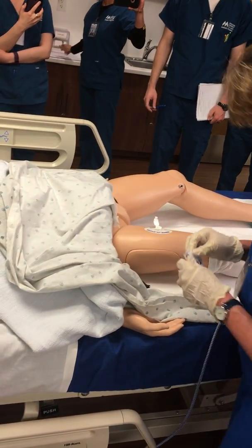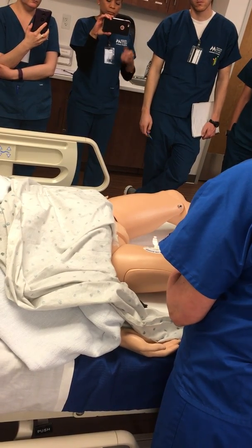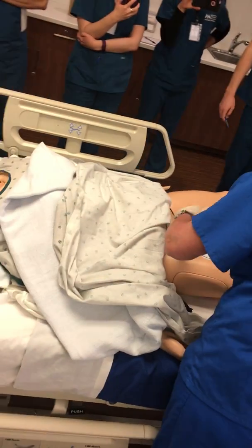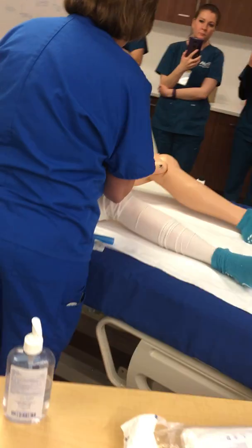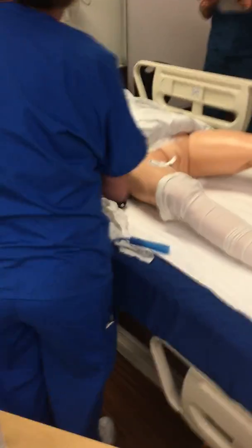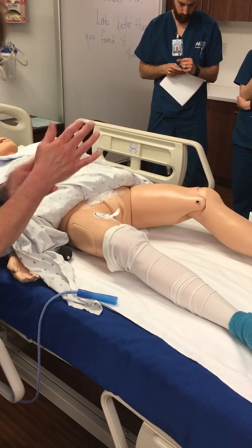Then I'll do the peri care. So I'm just going to wipe you down a little bit with a wet disposable washcloth here. It'll feel a little bit cool to you, but it shouldn't sting or anything. So I'll use one corner first — I'm going to spread and go down here. Then I'm going to use another corner, come on the side. I'm going to use a final corner and come right down the middle. What if they're on their period? I might have to do more cleansing. And then I'll take my gloves off and come do hand hygiene again.